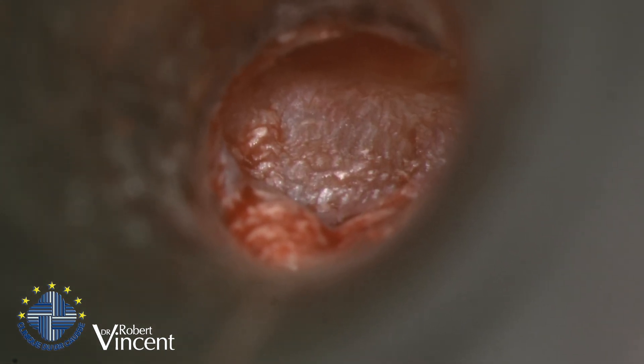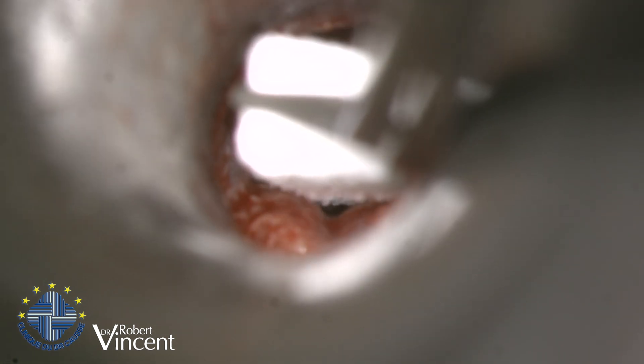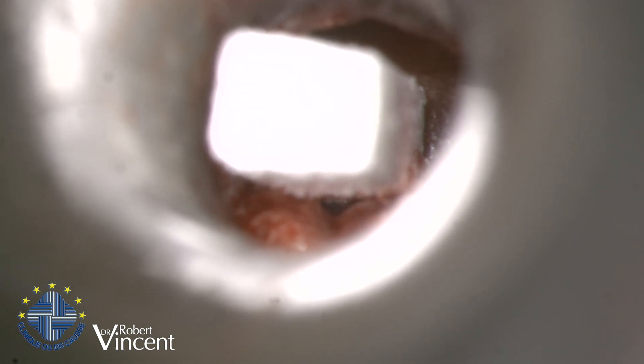The end step will be to place the ear canal packing, which I will remove on the fifth day postoperatively — as usual, with the ear pack for sound conduction.